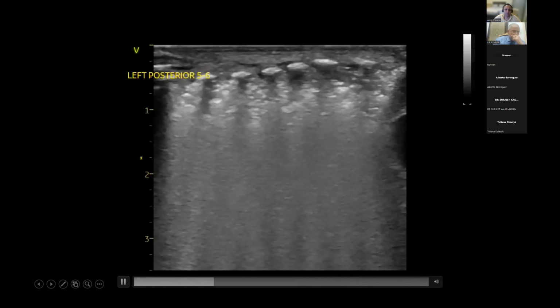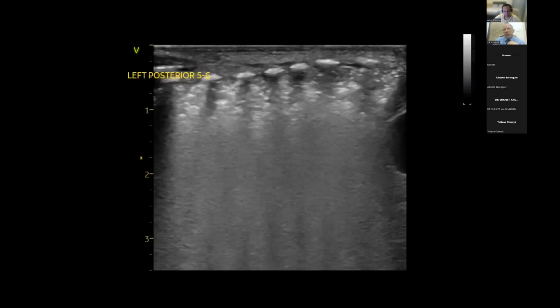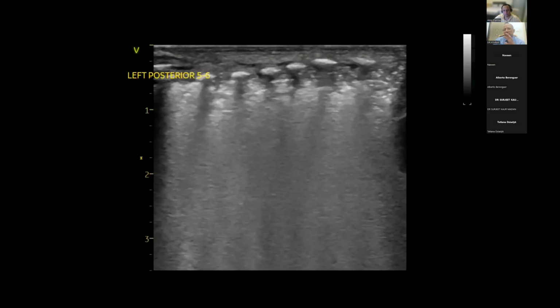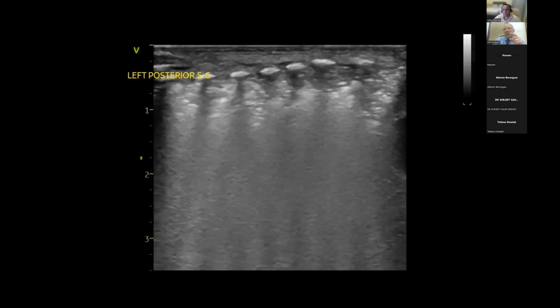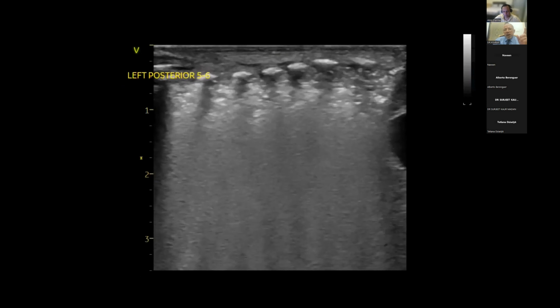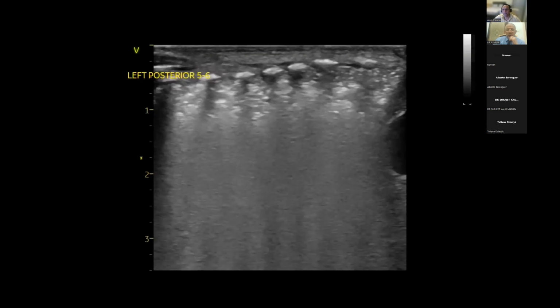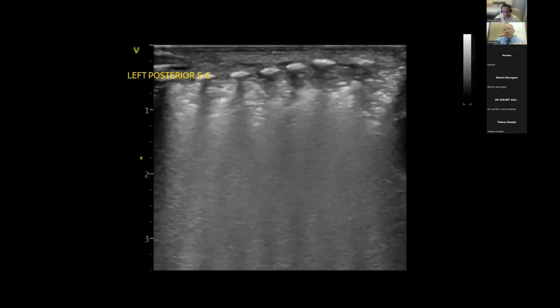This time I changed from conventional ventilation to the high frequency oscillator. I started by MAP 14, increased it little by little, then reached 18. After 18, I reached complete lung recruitment. For the following days, 15, 16, 17, I decreased the MAP one by one. I started with frequency 280, now 235. I started by MAP 14, we reached 18, now 15.